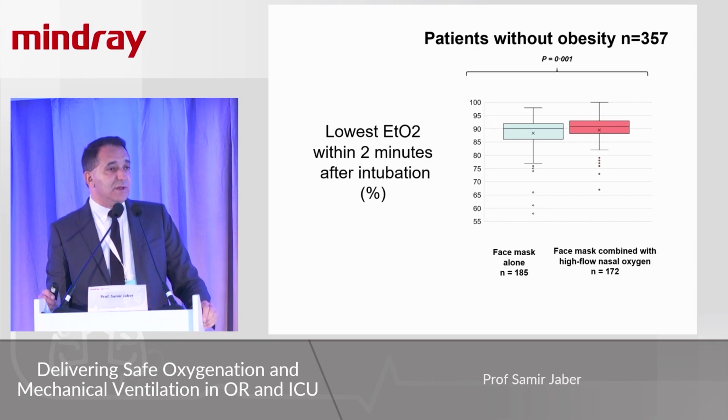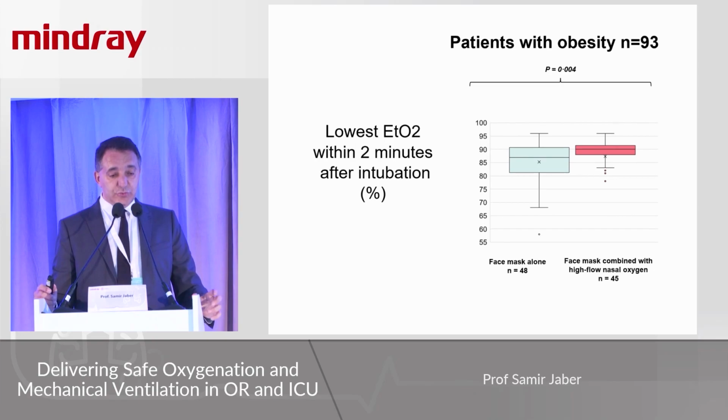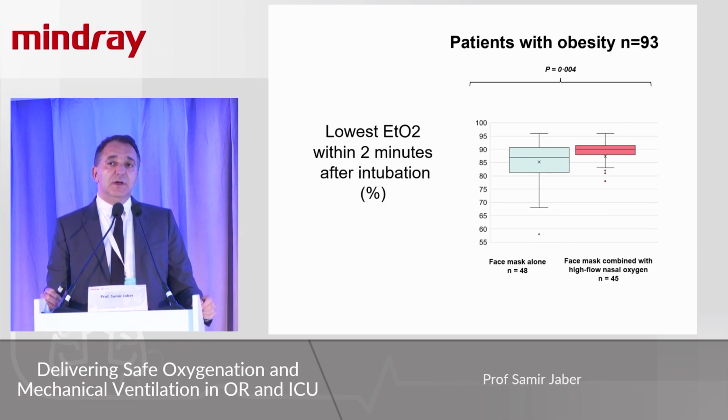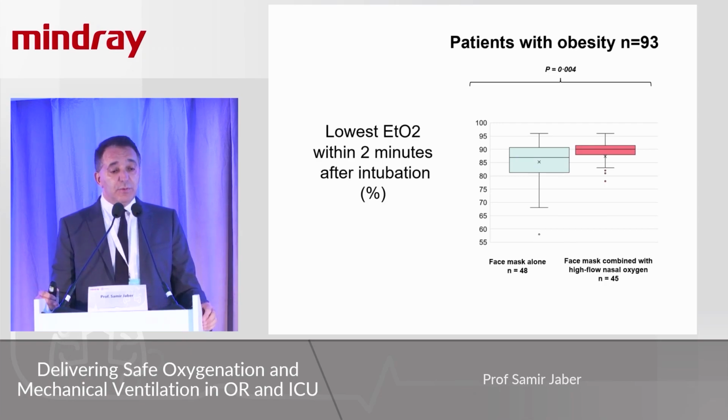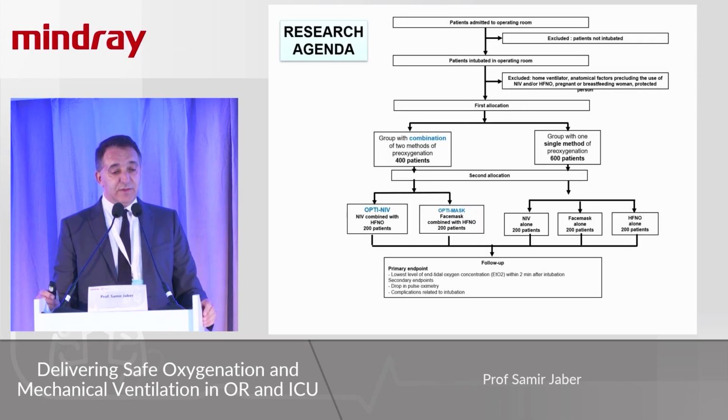The same is true in patients without obesity, and the same is also true, and more difference is in the obese patient. So this technique works in every patient. This is a proof of concept of the study, and it works, and it was safe.